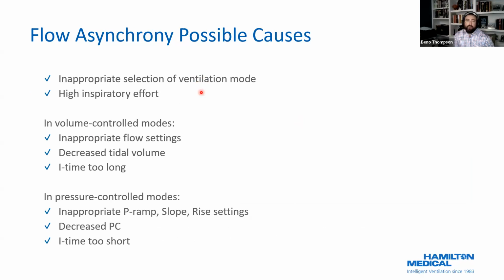Literally every other mode on the ventilator has variable flow other than fixed flow volume control, or VCAC, or SCMV if you use a Hamilton. High inspiratory effort, again, if they're underPEEPed, that is also going to cause this. Going back to the stuff we just talked about with Yoshida and Carteaux and Neitz, right? If they're underPEEPed, they will have that instinctive diaphragmatic contractility that's going to cause lung injury.